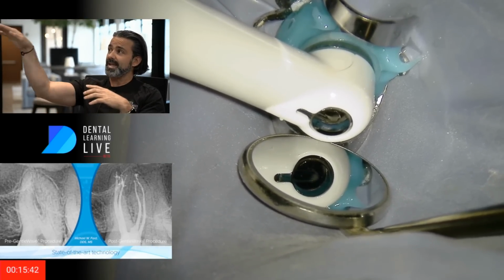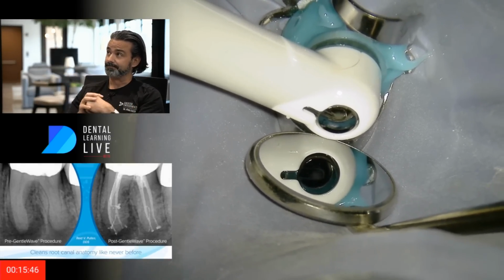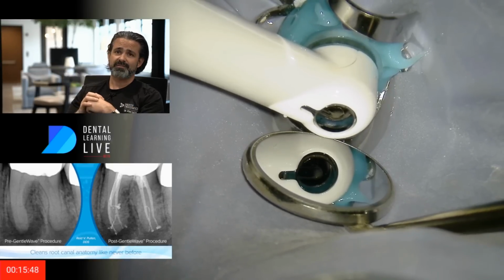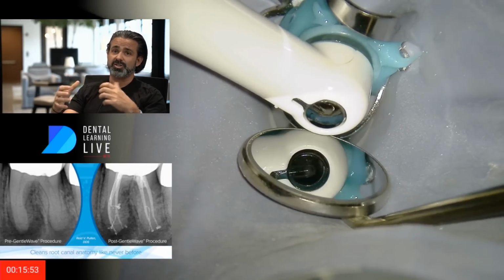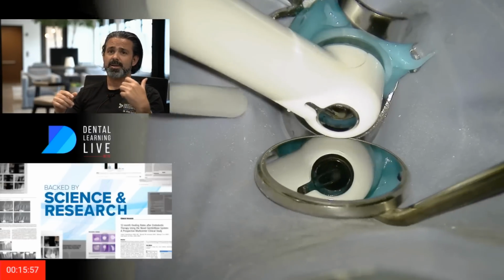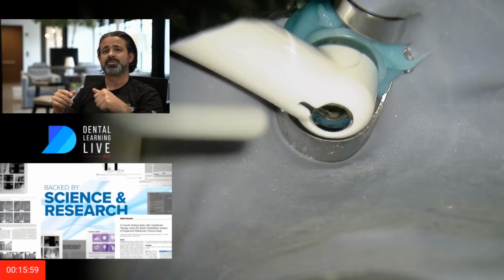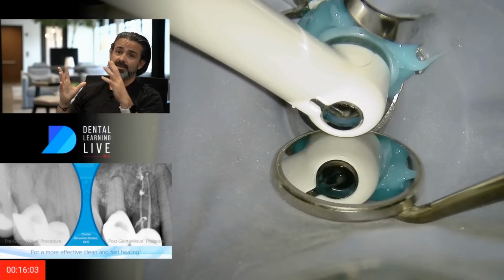And you can see that bubble dancing, and as I'm moving around, I'm just trying to find the sweet spot and making sure that vent is patent. Sometimes some guys will actually use their other hand to hold, and actually, I'm going to do that here in a second. But if you do use your other hand to hold the procedural instrument on the tooth, you don't want to cover that vent, just FYI.